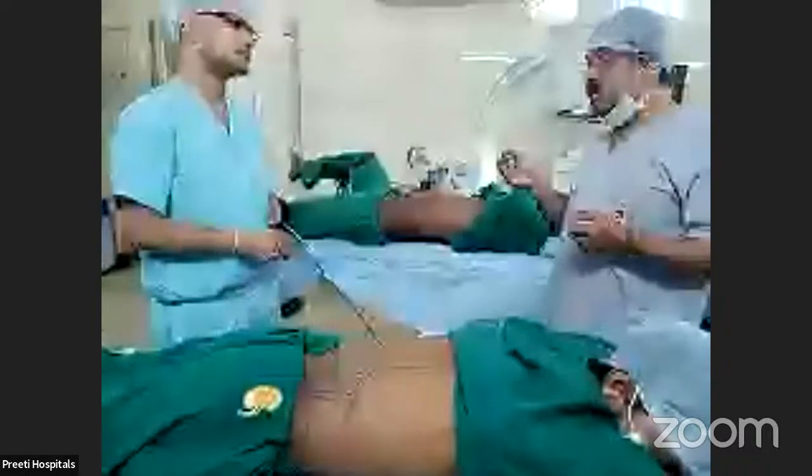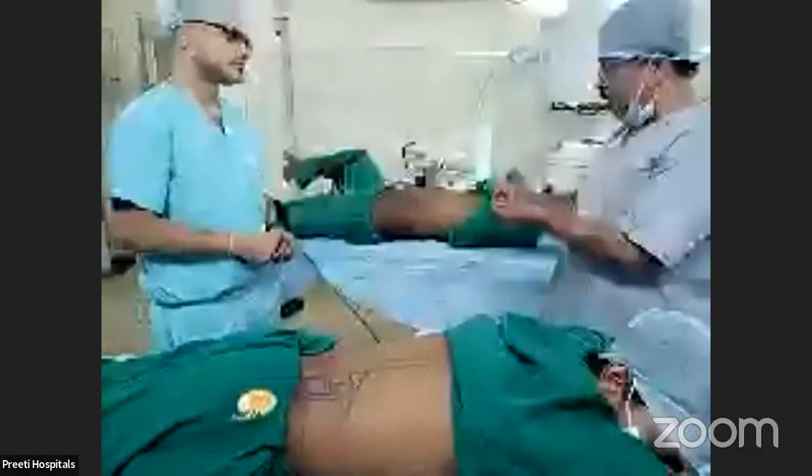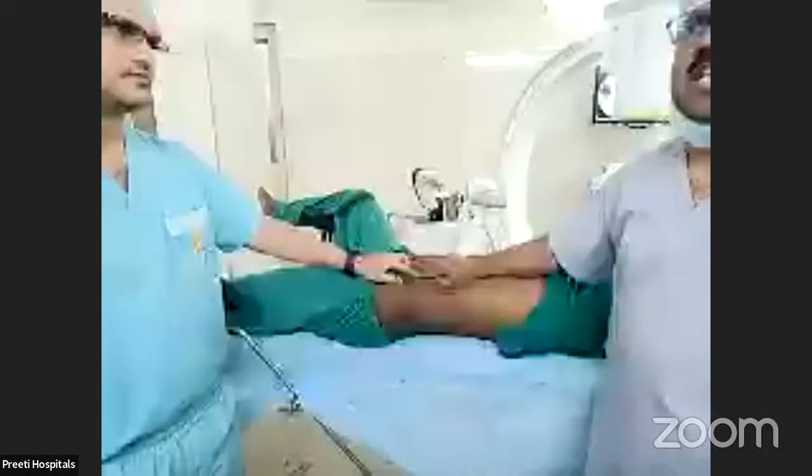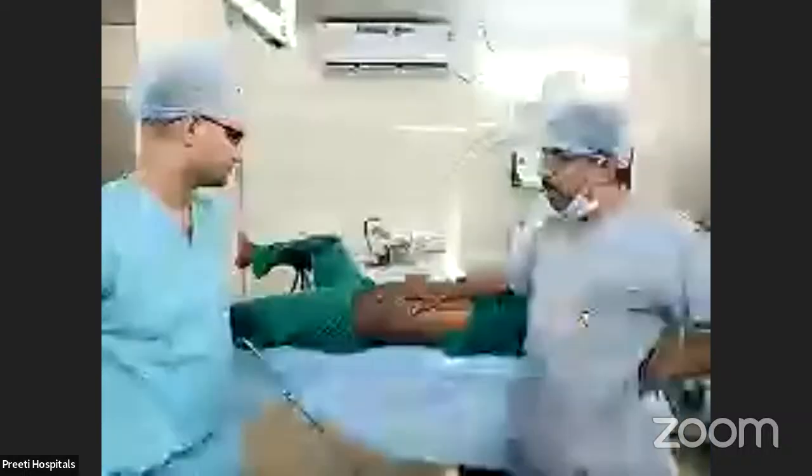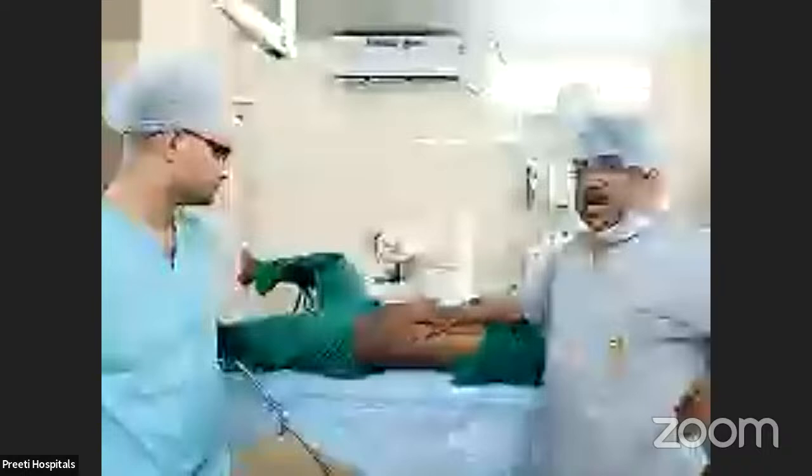But if the inferior stone is small, for example, there is a small stone here and a big stone there, then we do it by this. We will come from here and try to negotiate. If that fails, we can take the help of a flexible scope. For example, if a very small stone is there, coming in prone PCNL through this, that small stone may not be easy. So in that case, take out the stone, take this out also. If it is not coming, you put a basket and take it out.